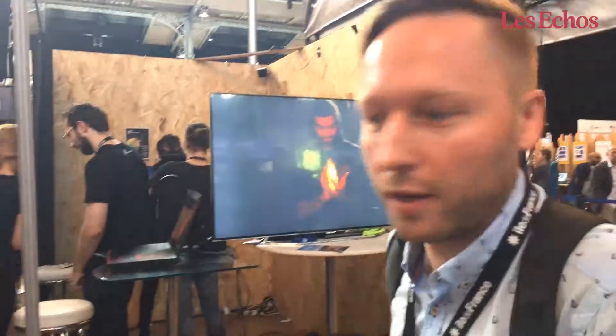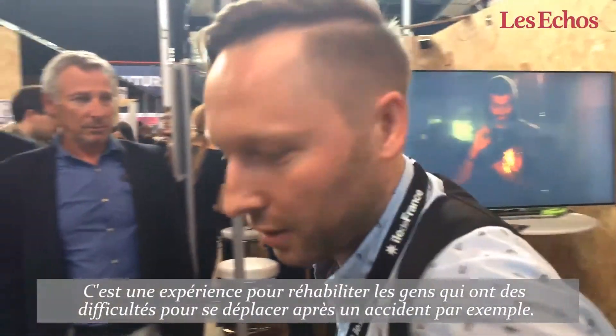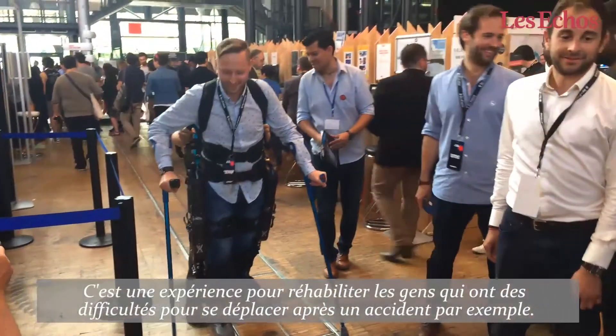This experience is about the rehabilitation of people that have some difficulties with the legs after accidents or similar conditions.